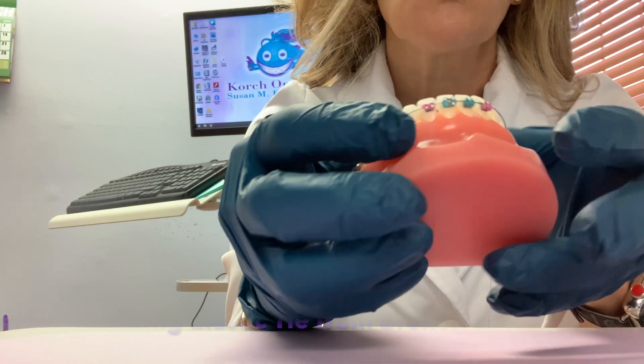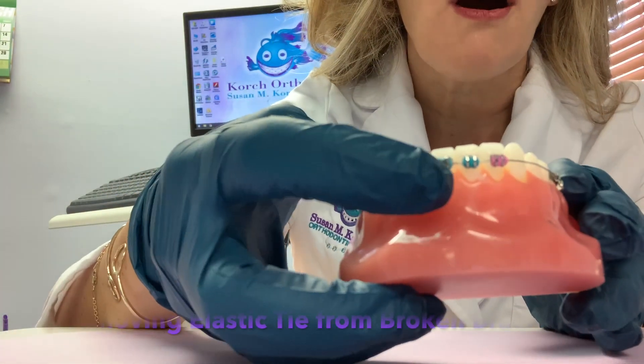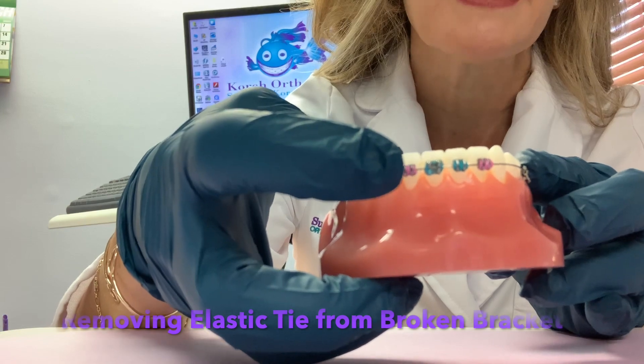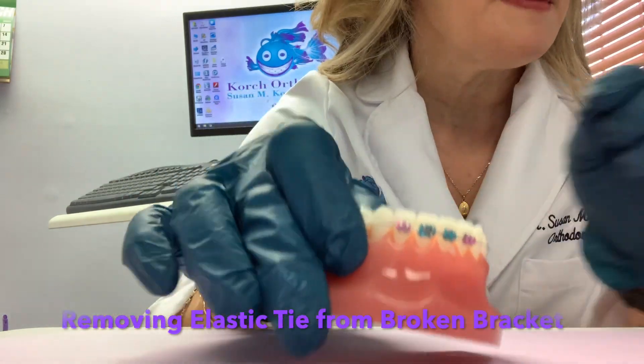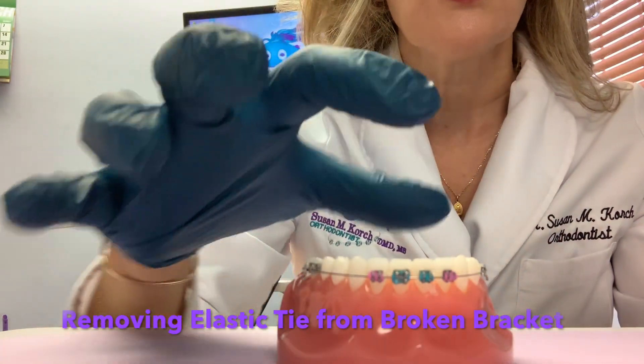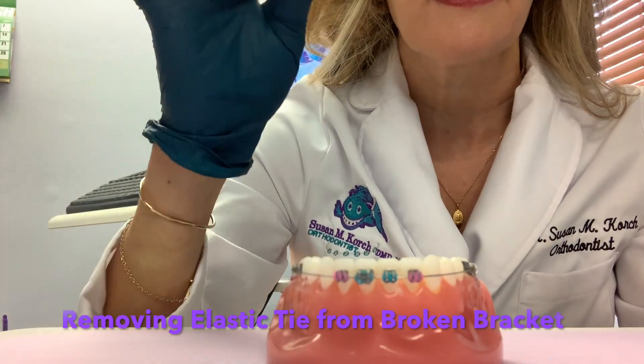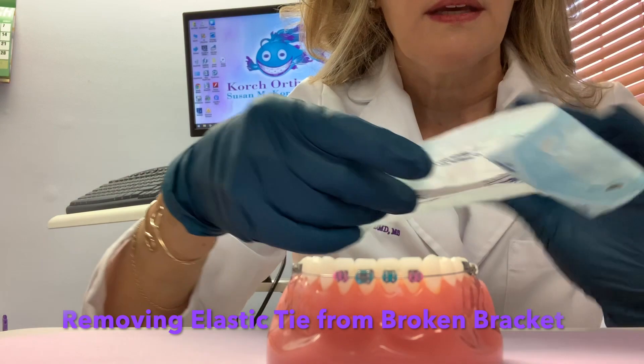I can have you take the actual little rubber band off of the brace, which would then allow you to take the brace out of the mouth. This may be a little bit difficult to do because they're tiny little rubber bands that are very thick.